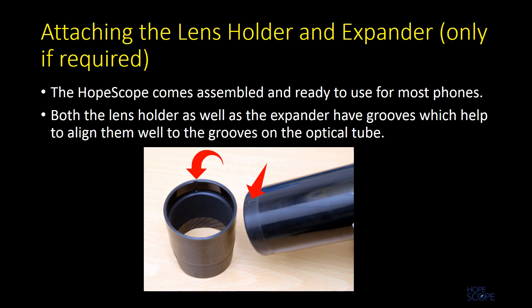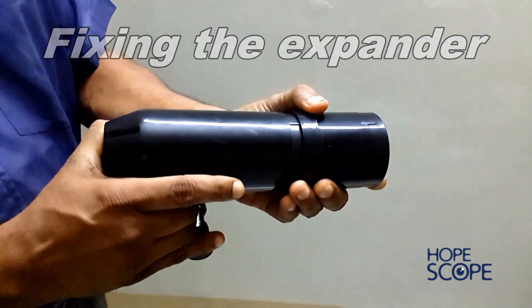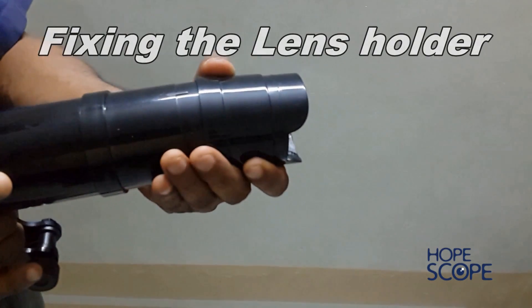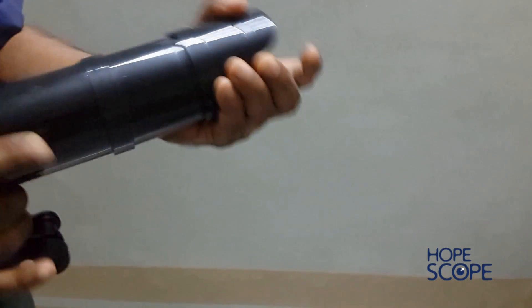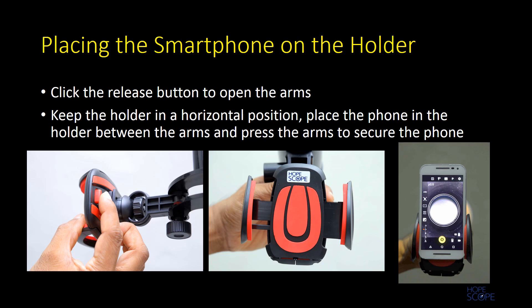The device comes assembled and ready to use for most phones. For phones with wider separation of flash and camera, the expander can be used to increase the length of the optical tube. There are grooves on both the lens holder and the expander as well as on the optical tube for guiding correct alignment. This video shows how to fix the expander onto the optical tube, and then the lens holder is fixed onto the expander to elongate the optical tube.